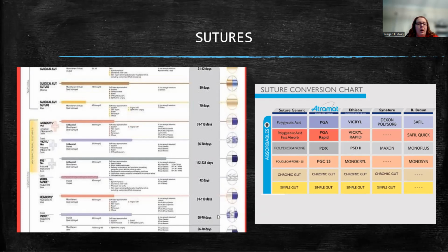So, not that you're typically the one that picks the suture for the case. However, the surgeon does expect you to probably have at least some basic knowledge of what you're handing them. Okay. And sometimes they don't even ask you for a specific suture. It's probably on their card, but they may just say suture. You need to look and see what you're working on and be able to pick the appropriate one from what you've got. You know, if you're doing the same case multiple times, like a C-section is pretty routine. Okay. You're going to close like the same layers of tissue pretty much every time. Um, so our doctors always use chromic to close the uterus.